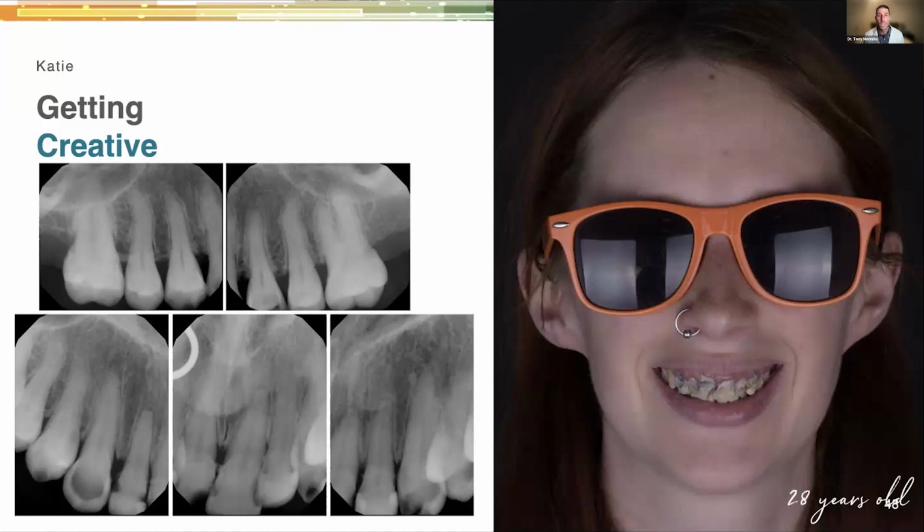Milling is there, right? Milling is there. Printing is getting there as far as being able to deliver really high term restorations. Yeah, and you made a point at the beginning that I loved, which is we're not comparing, the competition isn't whether a printed restoration is on par with Emax or zirconia, right? Because it's not, at least not right now. And I think it would be silly for someone to try and argue that it is.